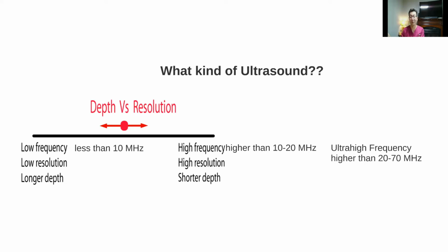Now, a lot of devices don't have that ultra high frequency, so you have to purchase a very different type of ultrasound. For those wanting to start using ultrasound, you could go to your anesthesiologist and borrow these high frequency ultrasounds. They give you relatively good resolution, and you could control the depth up to 2 to 3 centimeters, which would be enough to have an idea of where to locate the lymphatics and the vein.